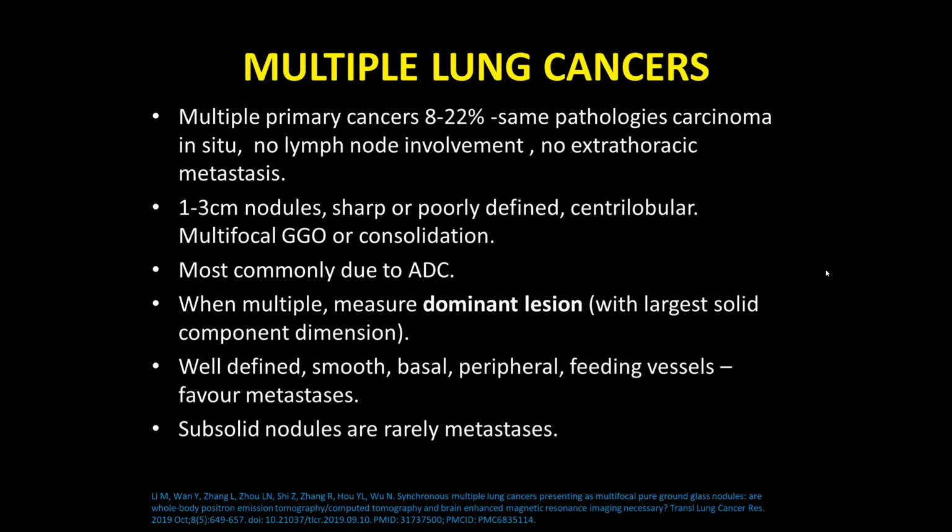Even on histopathology, it becomes very difficult. Even today, we just saw a patient who has multiple lung nodules, ground glass and solid, with PET uptake, and the PET also shows a segment of rectum showing uptake. So biopsy was mucinous carcinoma of the rectum. Lung also came as mucinous carcinoma of the rectum. So is this metastasis or is it synchronous primaries?